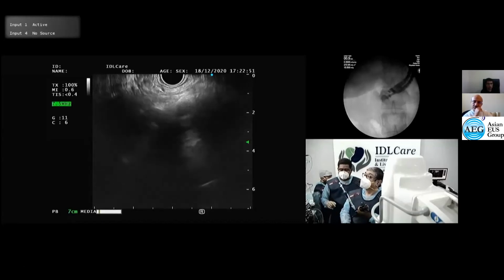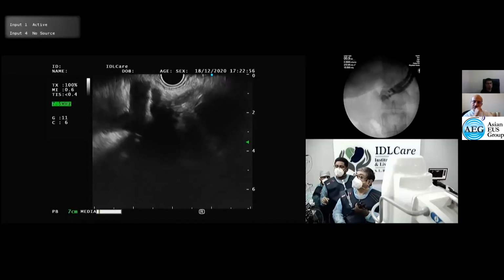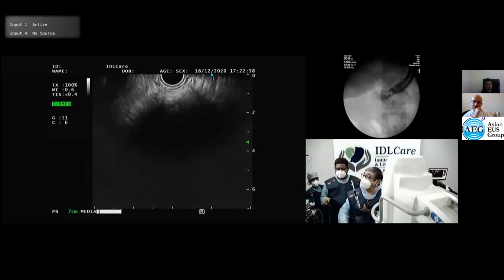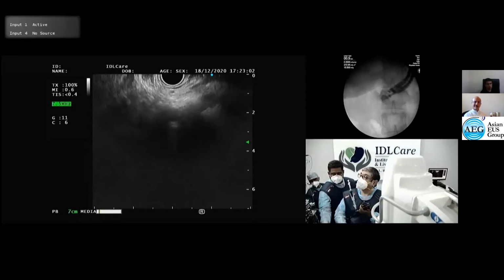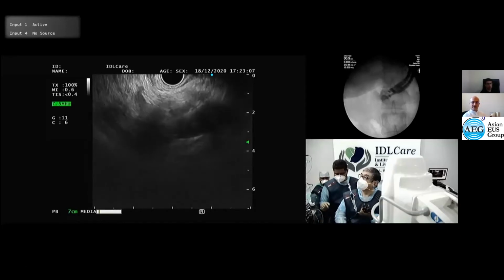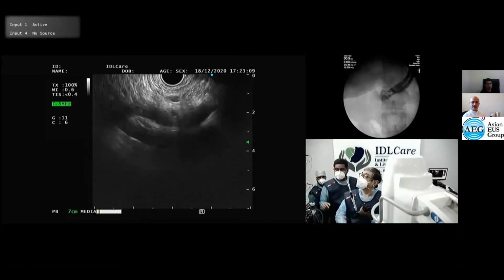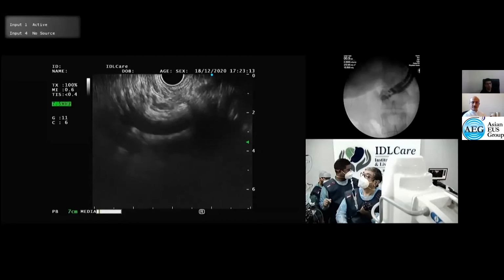So see, the position is also unstable. G junction, Dr. Teoh, isn't it? I am in the proximal stomach at about 43-44 centimeters. This is the aorta, you see, and in front of the aorta I should see the pancreas. That's a better view.